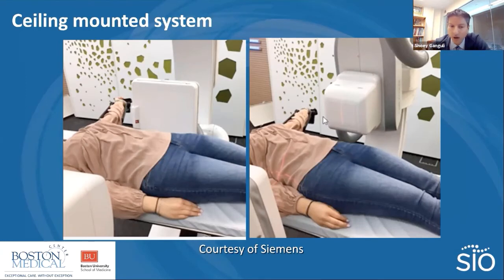The companies are aware that we're going to be needing this. This is from Siemens, and they're already thinking about ways that you can do cone beam without having to bring the arm in. I think as we come along, more and more people are doing radial, and we're doing cone beam. This is going to be part of our workflow, hopefully, so that we don't have to do these kinds of maneuvers. When you're moving the catheter, bringing the arm in, the microcatheter does move, so you want to watch under fluoro. But whatever you do with your team, the more you do it, the better you get at it. So really just pick something with your team, that is your techs and your nurses, and it becomes quicker the more you do it.